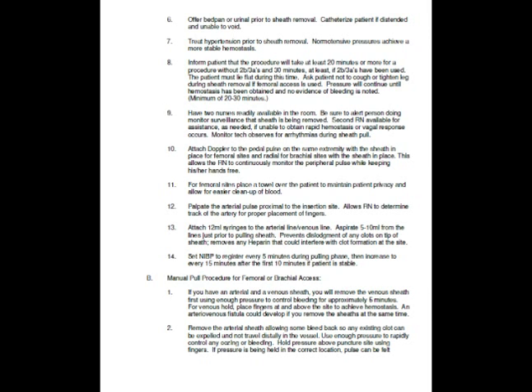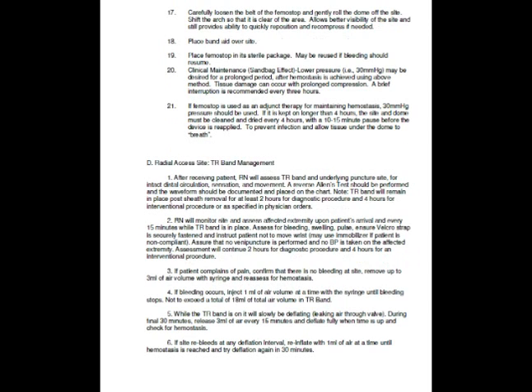So we've already talked about a lot of this. Let's go to... All right. Sorry. So C here is Femstop for femoral access sites. Again, you need to obtain an order to use. The Femstop is not to be used as an alternative, but it does do a great job of telling you what you need to do. So look at 3 there.